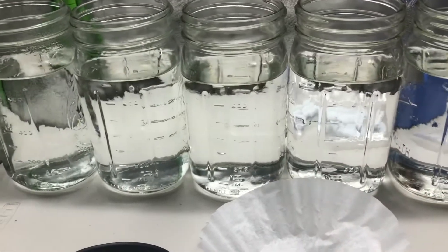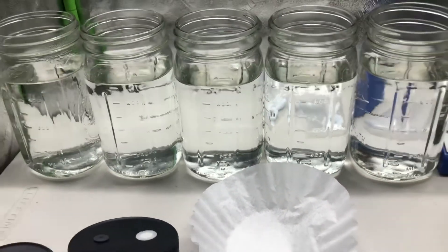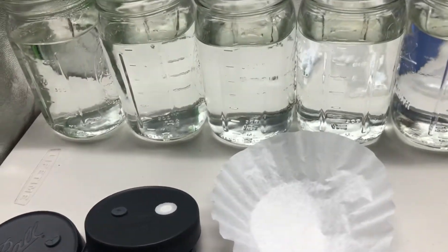I'll take you guys into the lab and show you the materials and procedure for making liquid culture. First off I have these one quart mason jars with 700 milliliters of just regular tap water. Distilled water is preferred but tap water works just as well.